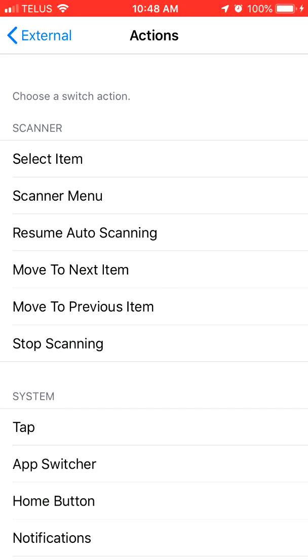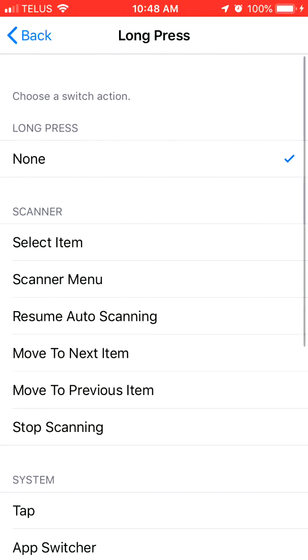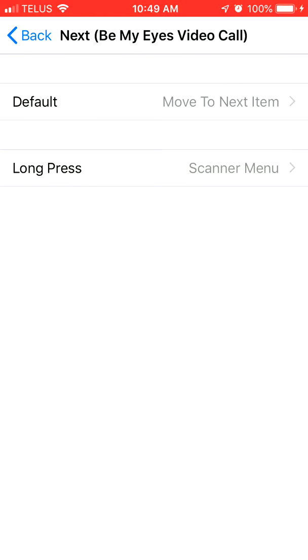So at this point, we have to again assign actions to this device. So for this device, the main action we'd like to assign is Move to Next Item. That's why we call it Next. However, we also do want to assign a long press action to this device. And the long press will be Scanner Menu. So now this button has 2 actions associated with it, a default action and a long press action, which in our case will be activated if the button is held down for 4 seconds.